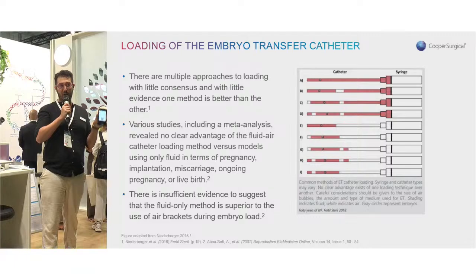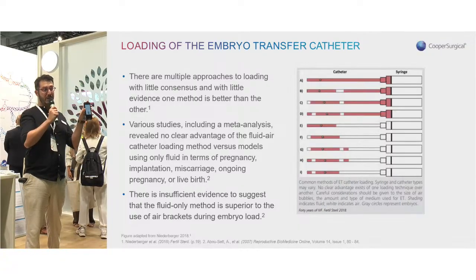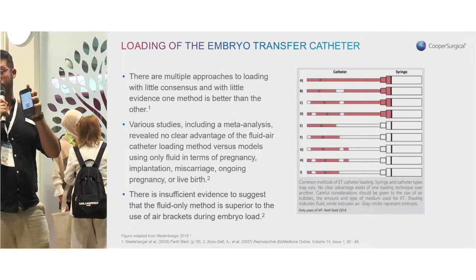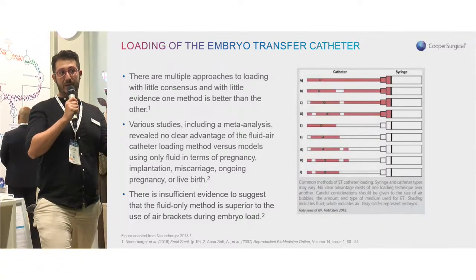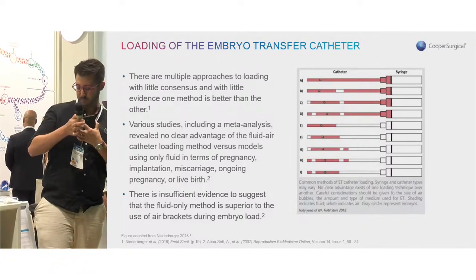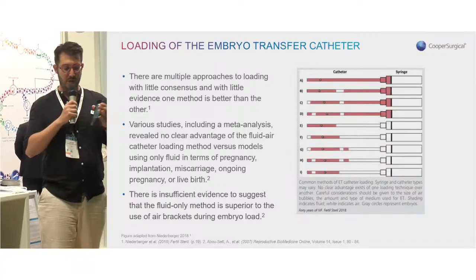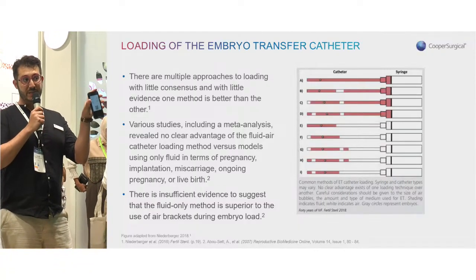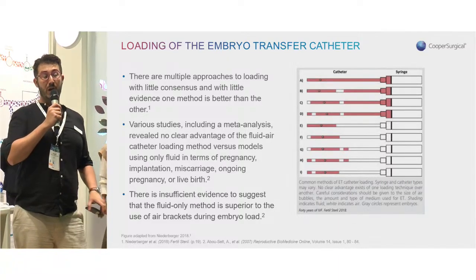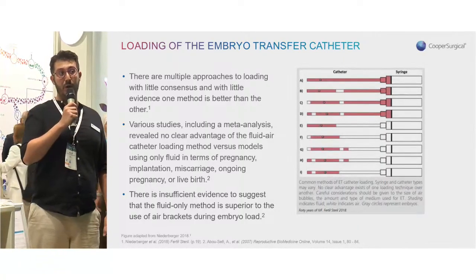So till now, we have been using patient ID cards, wristbands, biometrics like fingerprinting, but now we have an electronic way for patients to be fully ID'd at any point in the process. So for a transfer like now, what will happen is the embryologist will walk into the room to ID the patient, and they will be able to scan this. So what I just did is scan this ID from the patient, and my transfer station is now locked in place to this patient. So when I go to the incubator to grab the dish and bring it out for a transfer, it will be IDing and making sure it matches with the process.